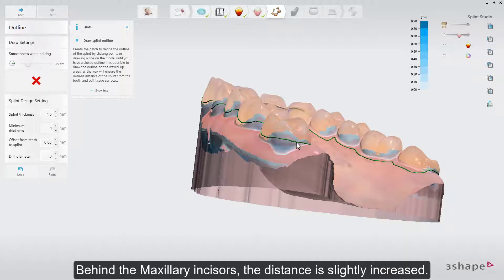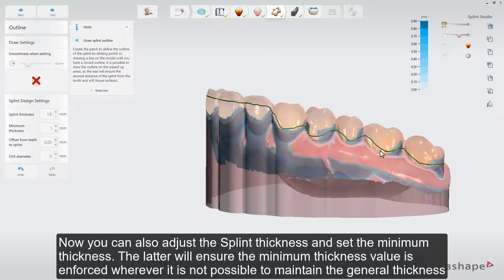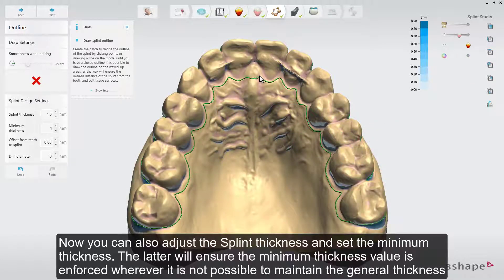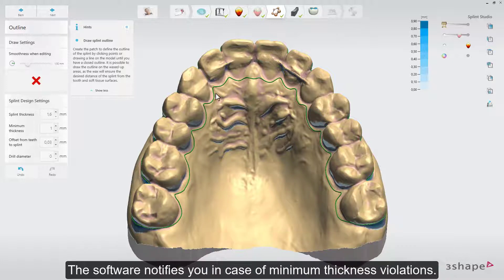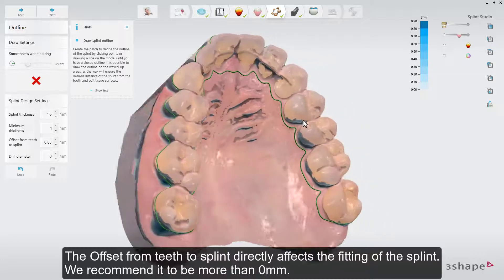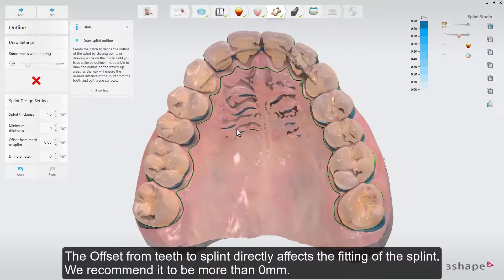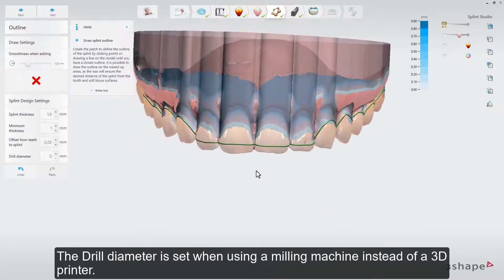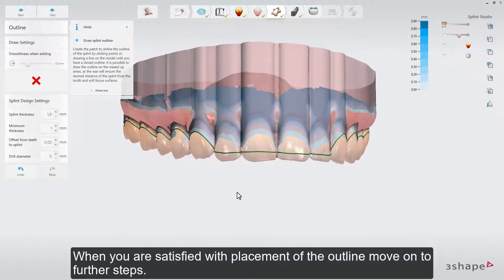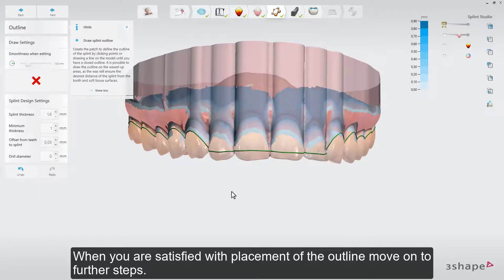Behind the maxillary incisors, the distance is slightly increased. Now you can also adjust the splint thickness and set the minimum thickness. The latter will ensure that the minimum thickness value is enforced wherever it is not possible to maintain the general thickness value. The software notifies you in case of minimum thickness violations. Minimum thickness will depend on the specific machine manufacturing process selected. The offset from teeth to splint directly affects the fitting of the splint — we recommend it to be more than 0 mm. The drill diameter is set when using a milling machine instead of a 3D printer. When satisfied with placement of the outline, move on to further steps.